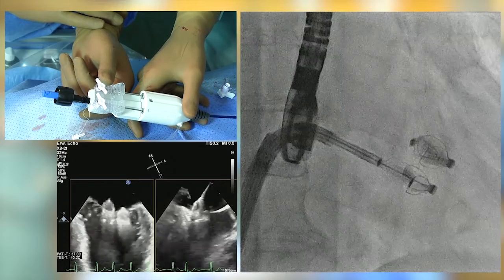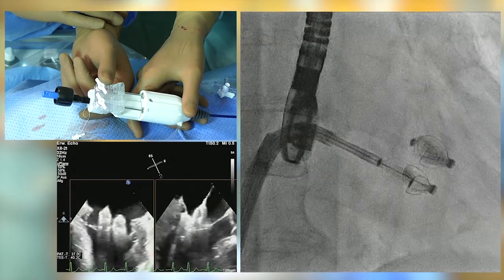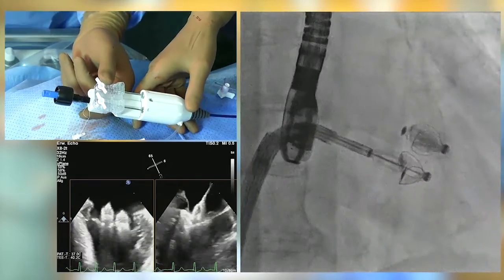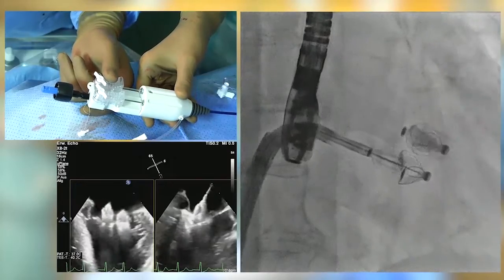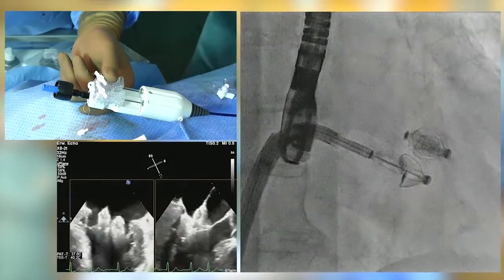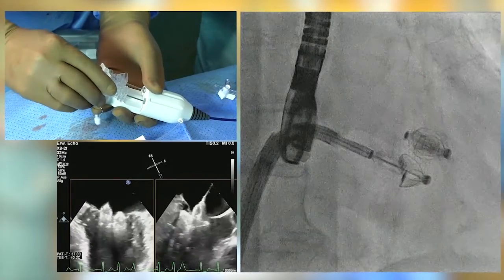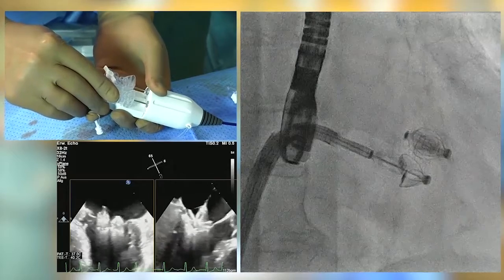Which we will do in a second. Here, the possibility would be to retract the device even further, but we thought that that should be sufficient. Double checking on fluoroscopy. Obviously, fluoroscopy can be used even better for the second implant because the first implant provides a nice landmark for maneuvering and also to ensure clocking.